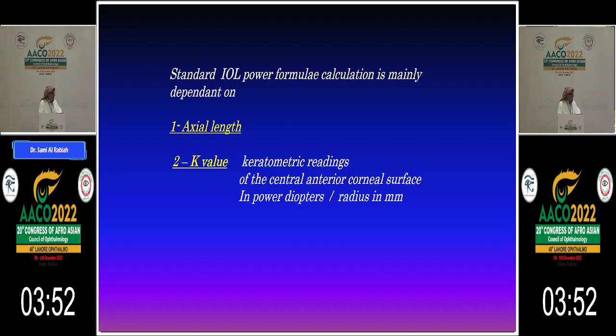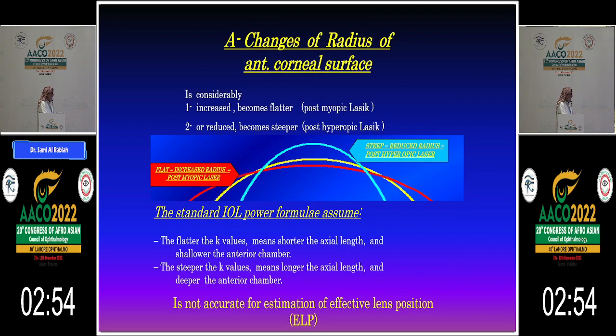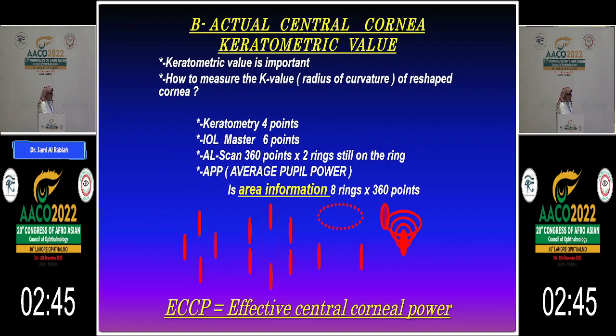And then reading our measurement. What's this? This is about the corneal shape. It changes. It seems to be either deep or shallow by changing. And then this is the radius, corneal surface anterior to posterior, which is 81. And this is the measurement. As we said, it is not in the center. It is around the center. Now, and this is here the power of the cornea. So if it gets flatter, the machine thinks it is shallow AC.